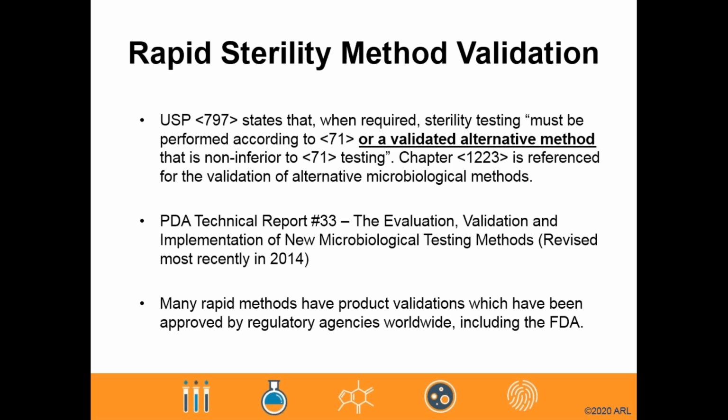Since the validation is considered hugely important, and they can vary based on technology used as well as the lab's implementation of that technology, the FDA has not blanketly accepted any rapid sterility technologies as a whole. They are, however, open to reviewing validations of methods where they have been approved on a case-by-case basis.